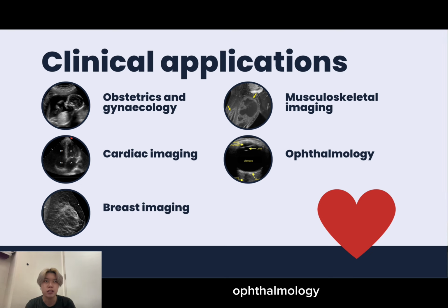Lastly is ophthalmology. An eye and orbit ultrasound measures and creates comprehensive images of the eye and orbit using high-frequency sound waves. Compared to a standard eye exam, this test offers a far more thorough image of the inside of your eye. This process is useful for both detecting eye ailments and diagnosing eye diseases.